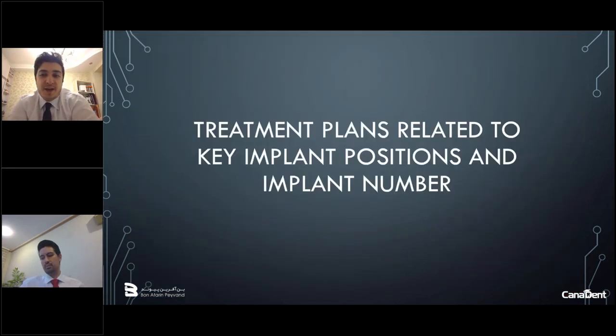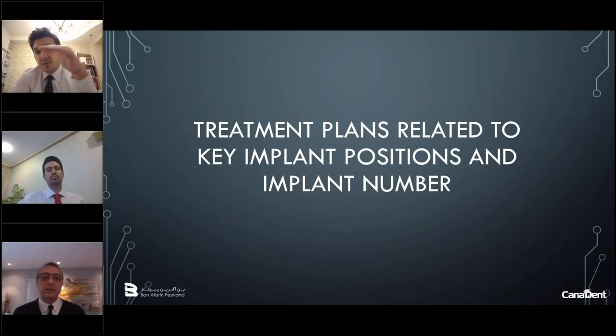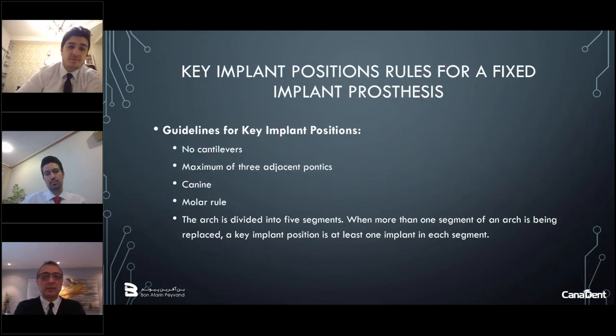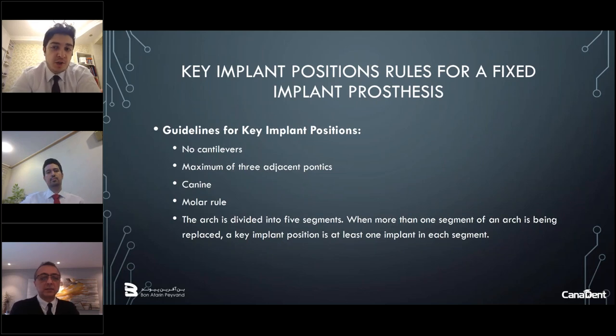Okay, now that we have the essentials, it's time to understand the correct position and correct number of implants for predictable long-term dental rehabilitation. If you follow the path of the presentation, you see that we first introduced how to choose our fixture, then we went to patient selection, then to assessment of the site and whether we need any augmentation, and now we are moving to the position and numbers. There are five general guidelines for implant positioning, which in the following slides we will talk about individually.